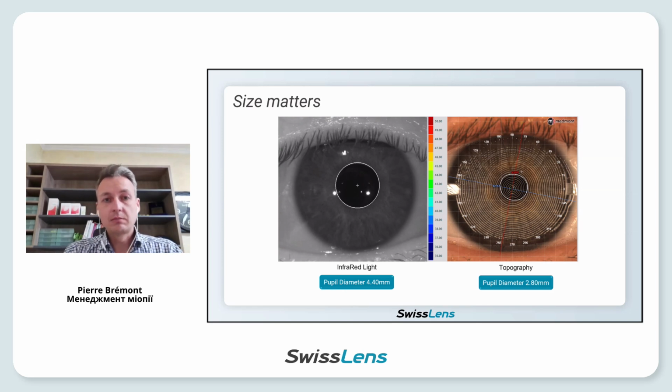And you can see that between the dark condition and the light condition, there is a huge difference in pupil diameter. To make my order, I start with the mean value of these two measurements, so something close to 3.5, something like that.